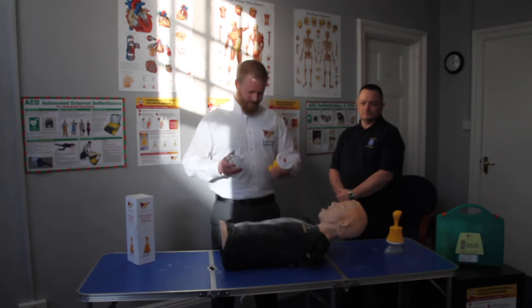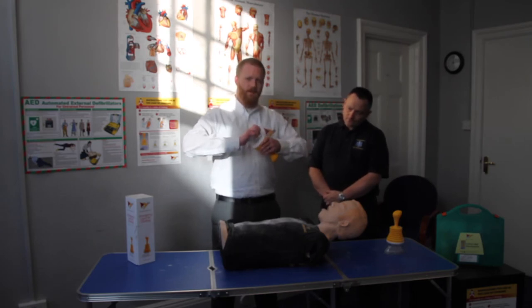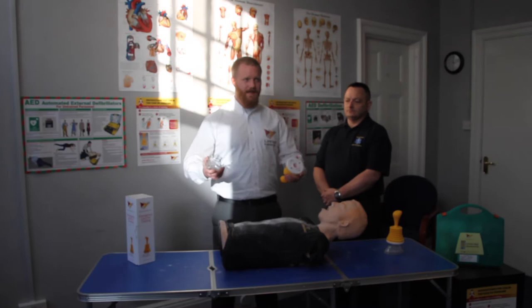LIFEVAC Assembly. It's very easy to put the mask in and out of LIFEVAC. To put the mask in, simply push and twist — it doesn't come out. To take it out, twist and pull. It's that simple.